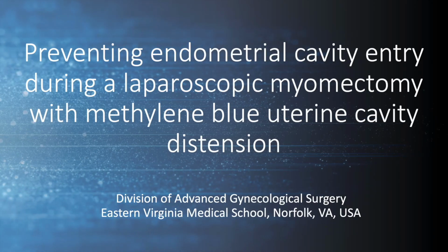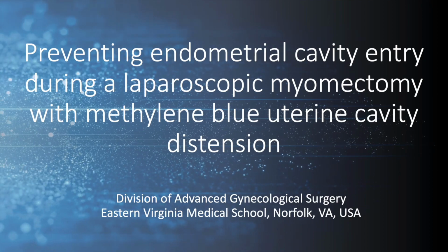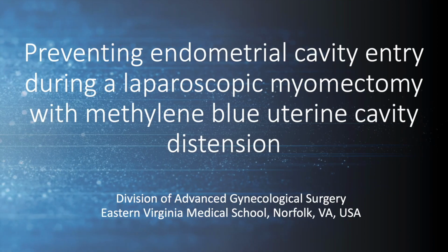In this video, we describe the prevention of endometrial cavity entry during a laparoscopic myomectomy using methylene blue for uterine cavity distension.